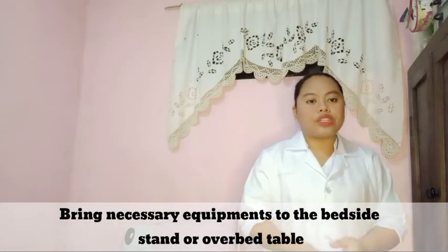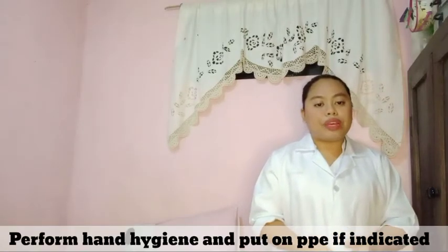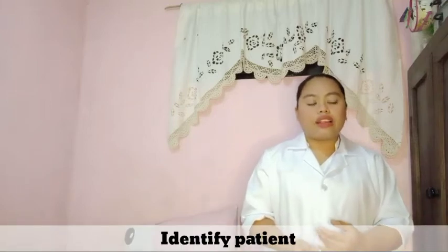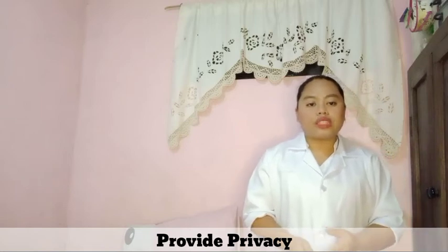For the implementation, bring necessary equipment to the bedside stand or overbed table, and then perform hand hygiene and put on PPE if indicated, such as mask or goggles. Identify the patient using the identifiers such as door tag, bed tag, wrist tag, or by simply asking the patient. Close the curtains around the bed or close the door to the room. This is to provide for the client's privacy.